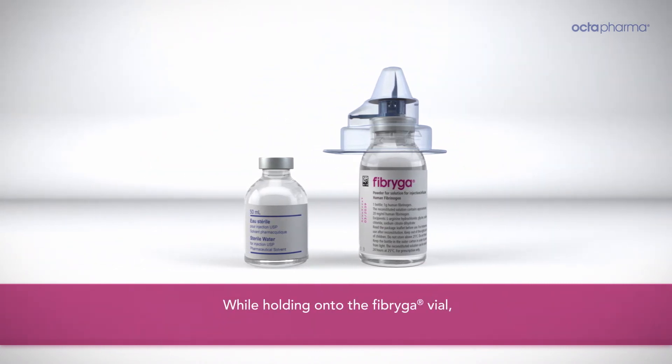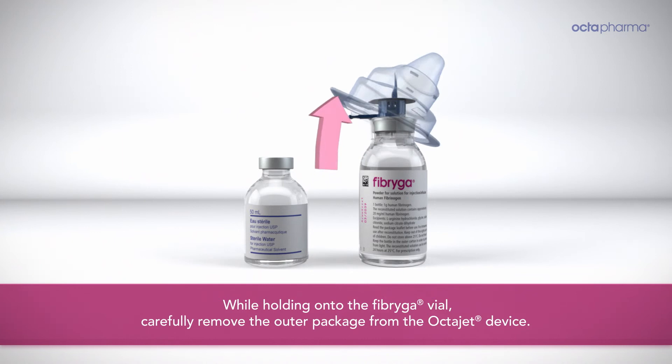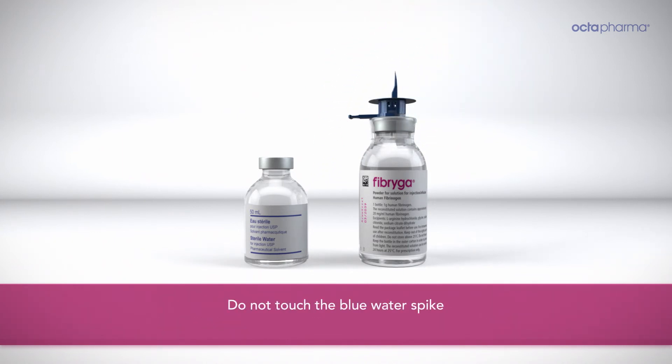While holding onto the fibryga vial, carefully remove the outer package from the Octajet device. Do not touch the blue water spike, and leave the Octajet attached firmly to the fibryga vial.